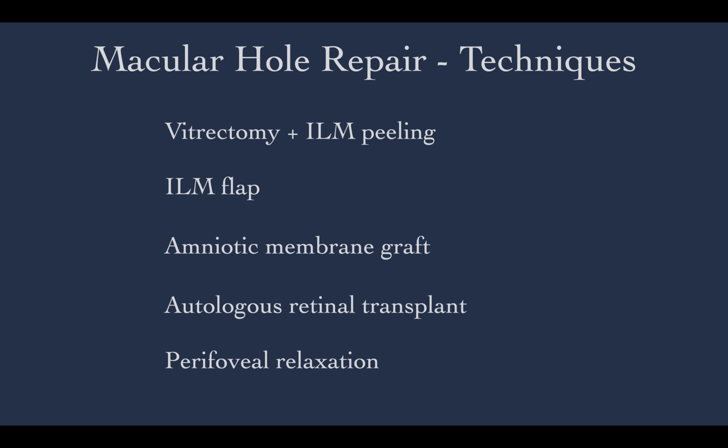The second technique is vitrectomy, ILM peeling with a flap, or the so-called inverted ILM flap technique. This may be an optional surgical technique for treating large macular holes and myopic macular holes with pretty high closure rates.